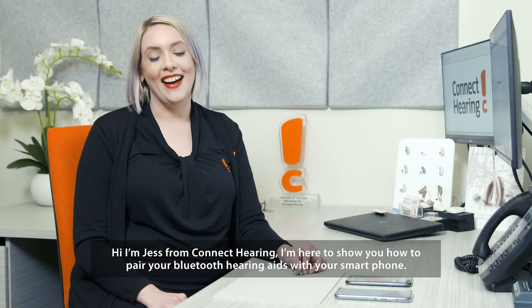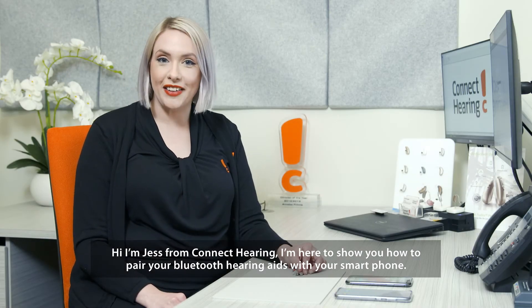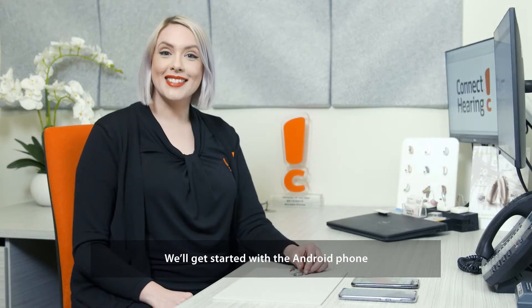Hi, I'm Jess from Connect Hearing. I'm here to show you how to pair your Bluetooth hearing aids with your smartphone. We'll get started with the Android phone.